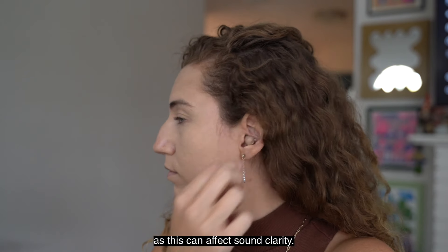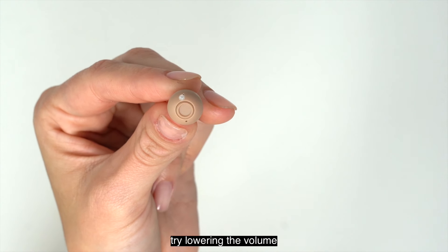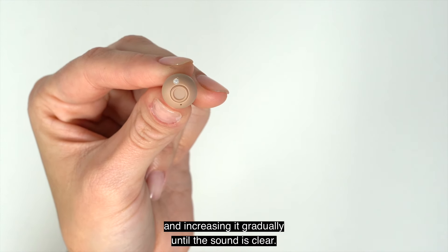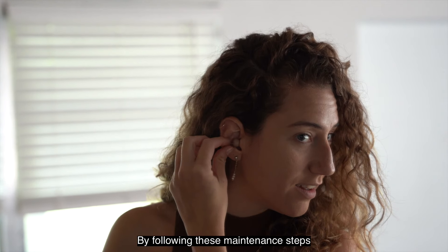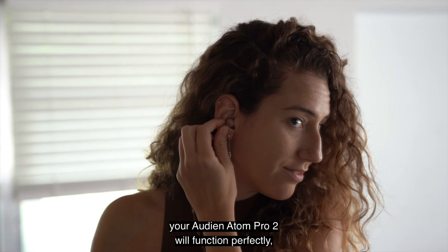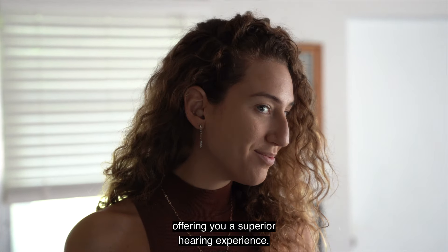To start, you'll need to charge the Audien Atom Pro 2 in the charging case for about two and a half hours. This will provide the necessary power to keep your device operational. Attach the larger end of the USB cable to your wall charger and the USB-C side to the charging case, then insert the wall charger into a standard outlet.